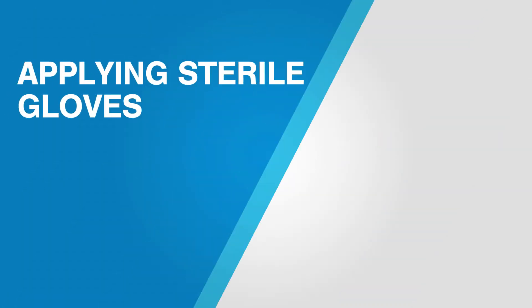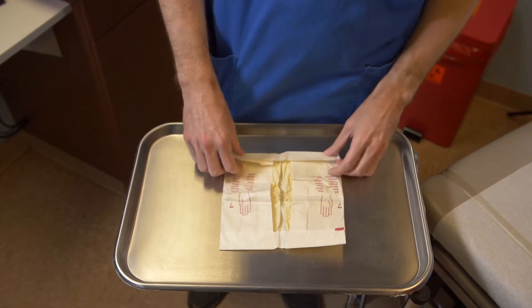Surgical asepsis: applying sterile gloves. Because the hands cannot be sterilized, anyone performing a sterile procedure must wear sterile gloves. The purpose of this procedure is to provide direction on how to apply sterile gloves without compromising sterility.